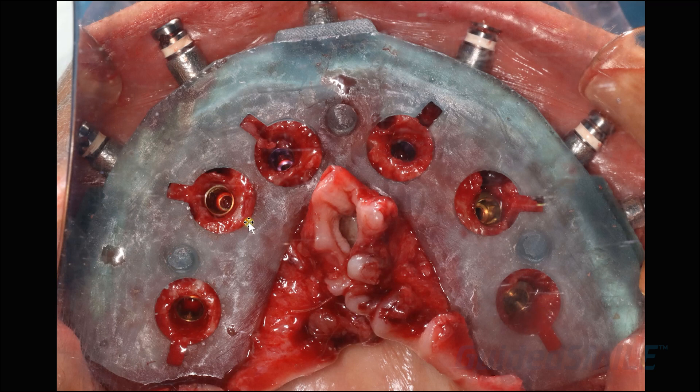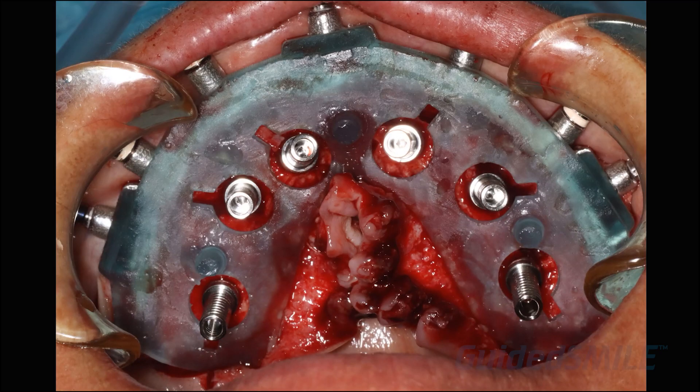With the implants in, the next step is to put the carrier guide back on and seat your abutments. The reason you want the carrier guide on is because these little notches indicate the trajectory of the screw for the abutment — the implant, the driver, and the abutment all go in this direction. When you put your abutment in the hole, the screw goes in, the driver goes in, and you tighten it down. The screw access holes would be right underneath here.